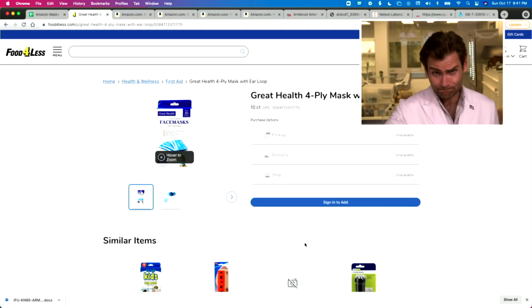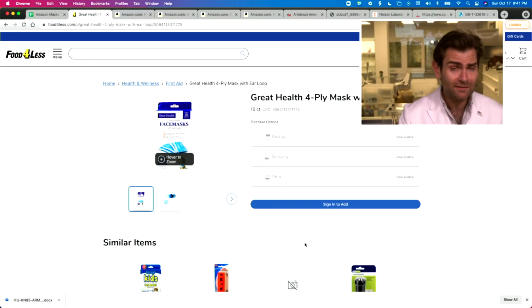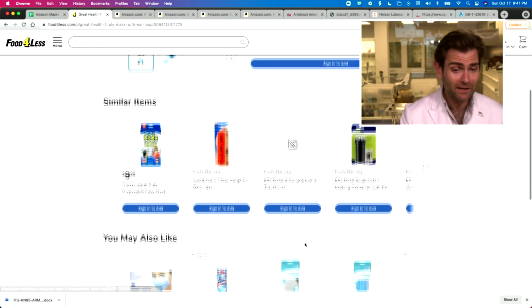Today I'm looking at the Great Health Disposable Face Masks, which I'm sure you've heard of. Actually, I haven't. So we may have bought them on Amazon. Actually, I don't know where they came from. They just showed up one day. I did Google it, and they are available on everyone's favorite website, food4less.com. So you can buy it on there, I guess. There you go. Anyways, let's put it in the clamper and see what happens.